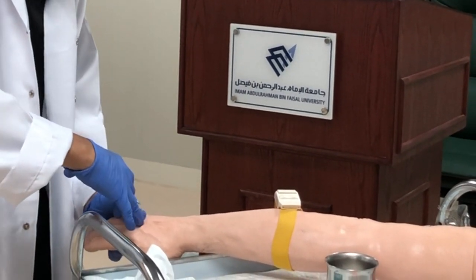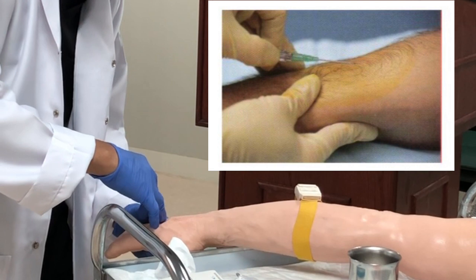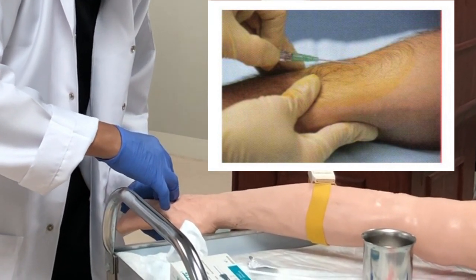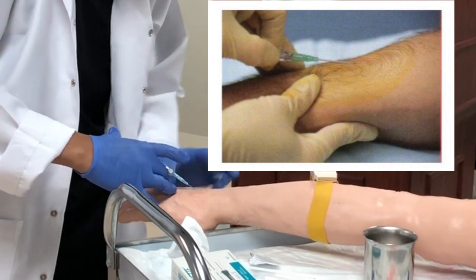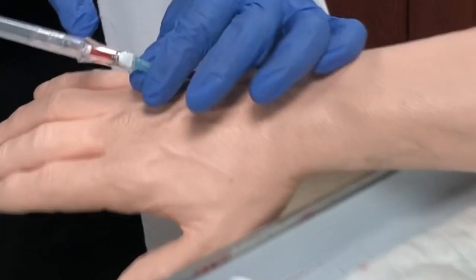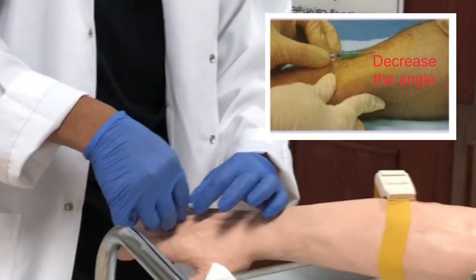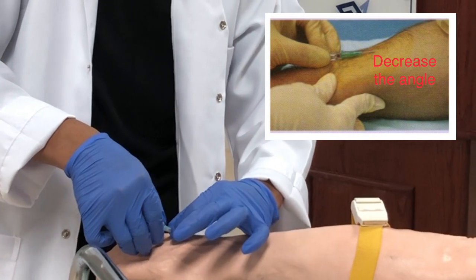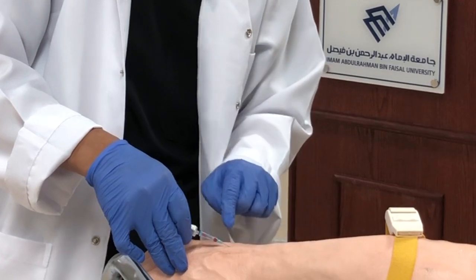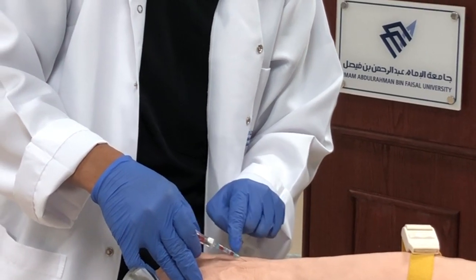Insert at a 10 to 30 degree angle. If you see the flash, do not push it further — check first for the backflow of blood. There should be a backflow of blood in the chamber. When there is a backflow of blood, decrease the angle of insertion and advance the IV cannula while withdrawing the needle one centimeter. There will be a second backflow of blood. The first backflow is at initial entry; the second backflow confirms cannula placement.